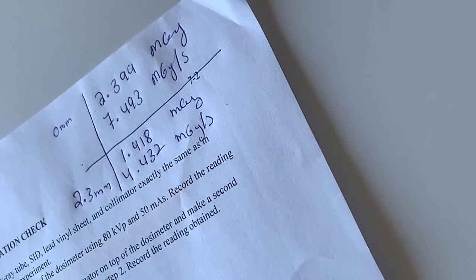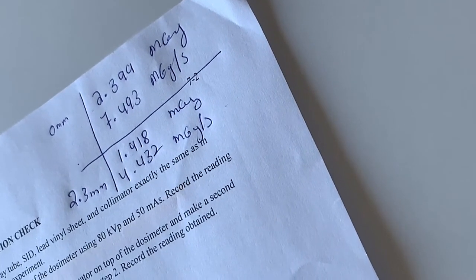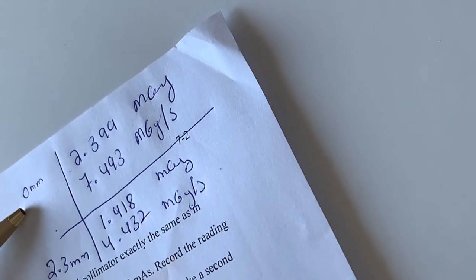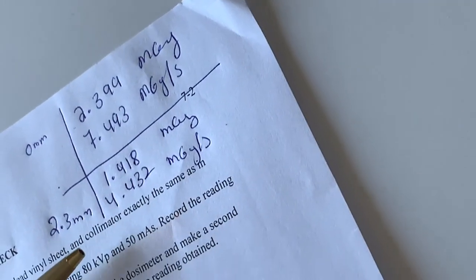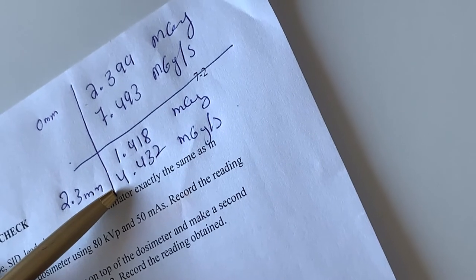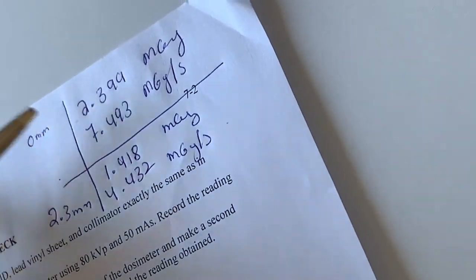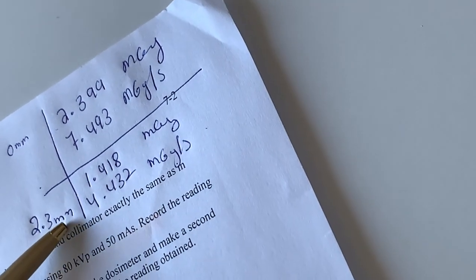Using the readings, we have to determine whether the filtration is sufficient. How do we know if the filtration is sufficient? The zero millimeter, which means no aluminum, should be double the values once the aluminum sheets are placed. So, you can see here that the values have decreased once the aluminum sheet has been placed.